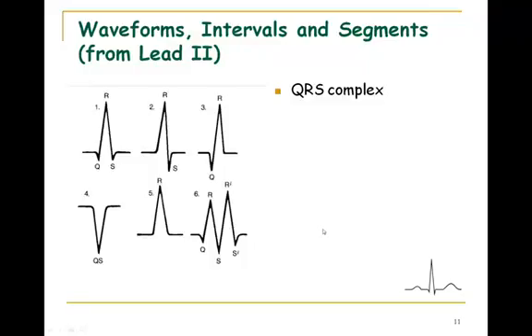What the QRS complex gives you information-wise, one of the things it can evaluate, is how conduction was through the bundle branches in the Purkinje system. Since the ventricles utilize the Purkinje system, if this is prolonged, it may tell you that we may have a block in conduction through the Purkinje system.